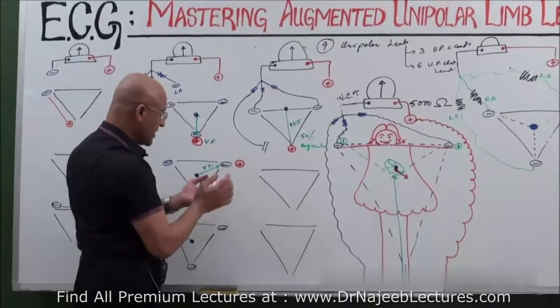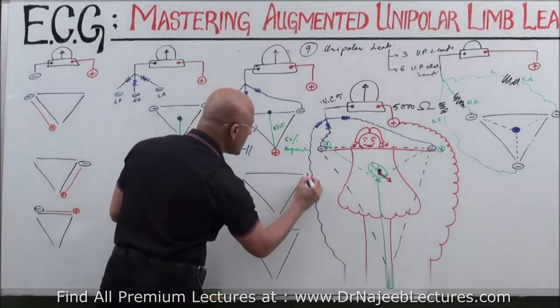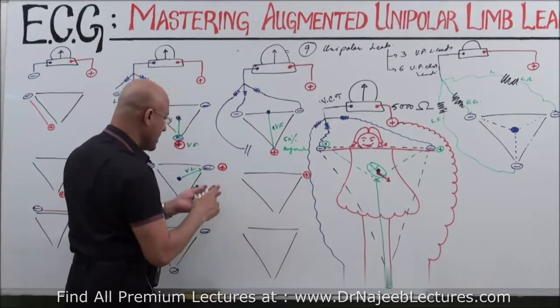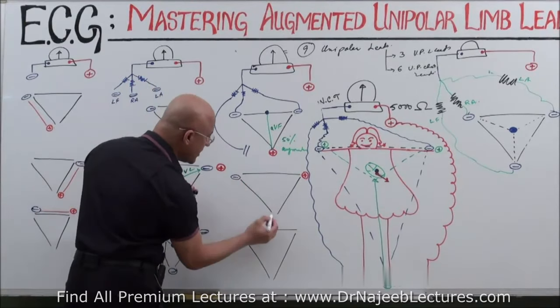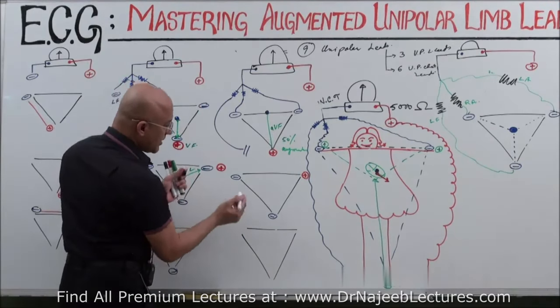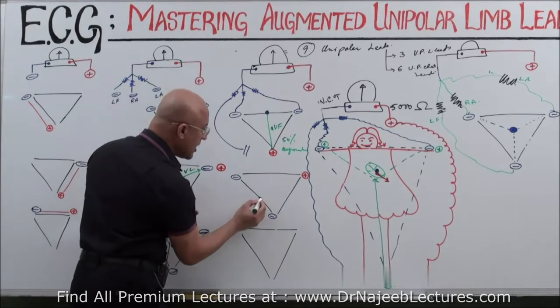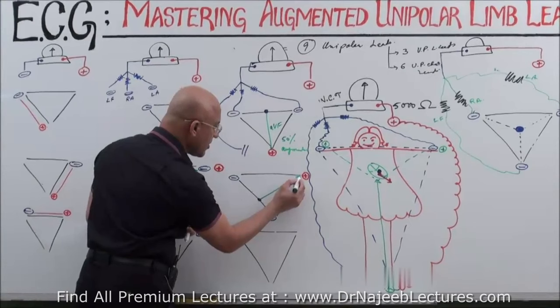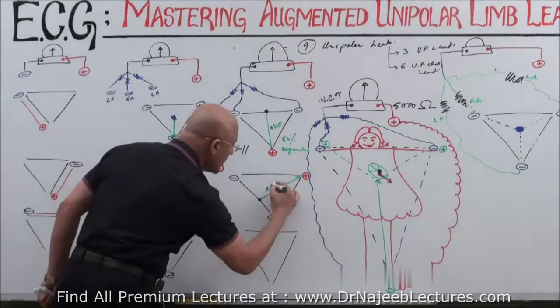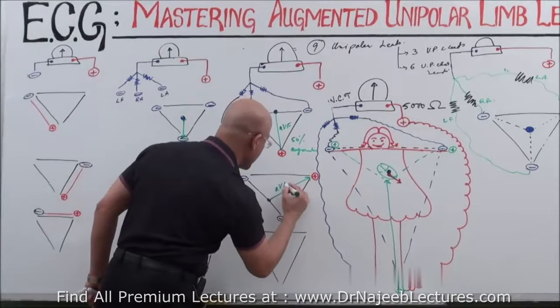For example, in this person now he put positive here. If he is putting positive here, then he is disconnecting this negative, and negatives are only here and here. So with Goldberger, this time it will shift in between them, and the axis of the lead will be the same. Now, by this way he has converted VL into AVL.